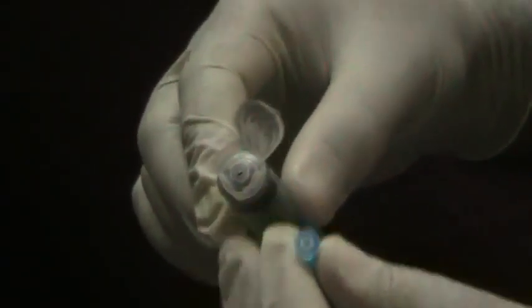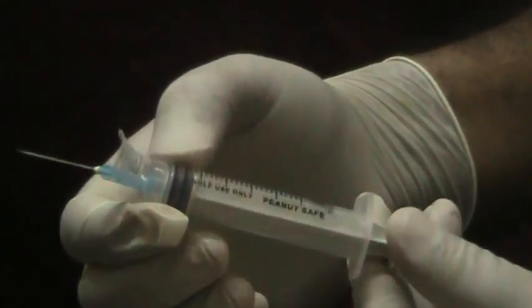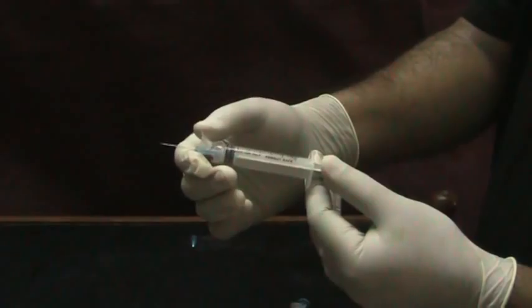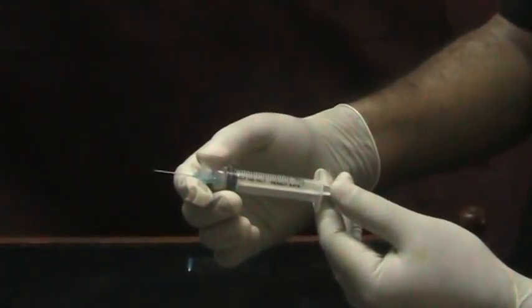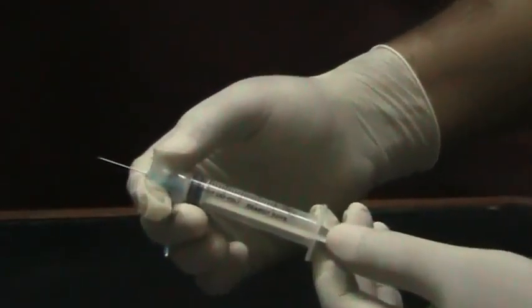It is simpler, cheaper, safer and cost effective. It is also the most eco-friendly reuse prevention syringe. All auto-disabled syringes permit only one forward and one backward movement.